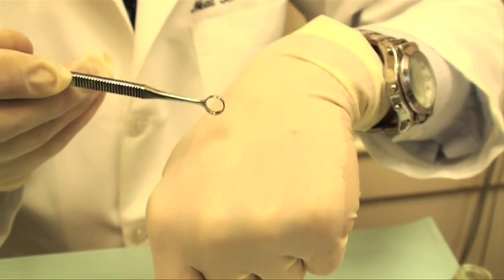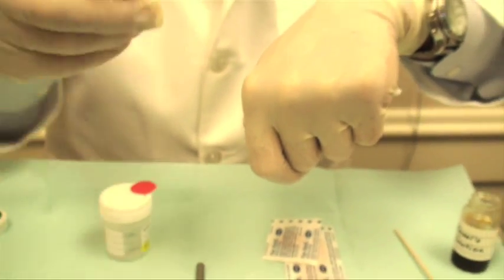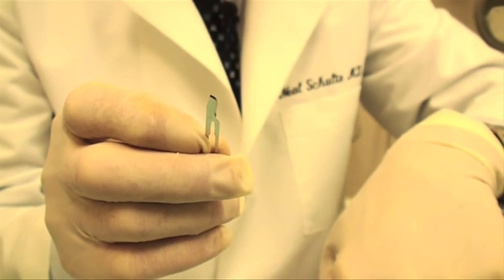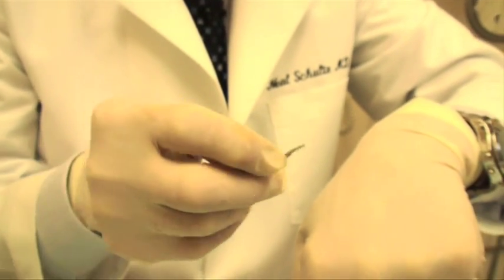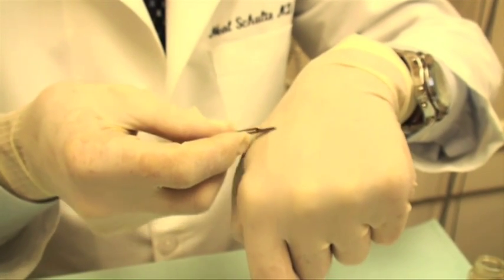Sometimes we can't remove it just by scraping — sometimes we need a scalpel blade. This is a small one, it's very sharp. And don't forget, the skin has been injected with local anesthesia, so it's completely numb. And sometimes we use a sawing motion with that blade to actually cut off the growth.